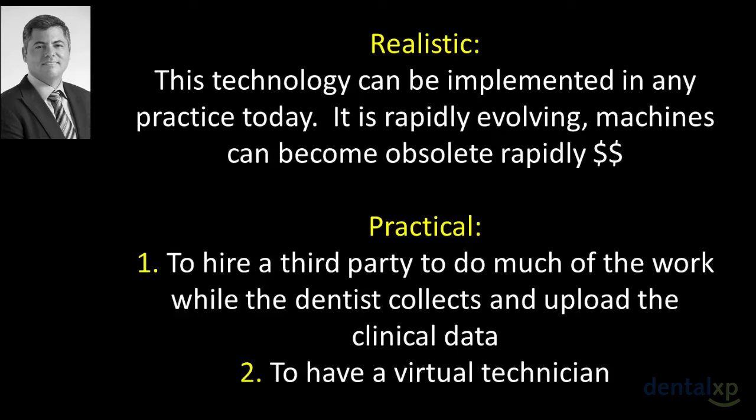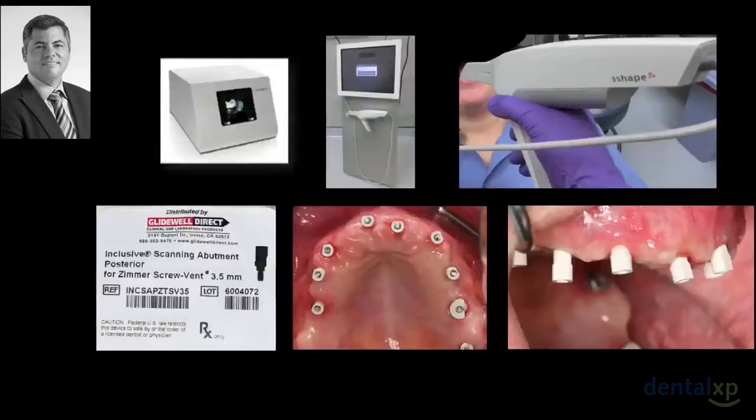Intraoral and countertop scanning is now being performed in more dental practices. More dentists have now digital labs in their practices. These digital labs have cone beam CT scanners, laser scanners, 3D printing, and 3D milling machines that can provide a full scope of solutions.